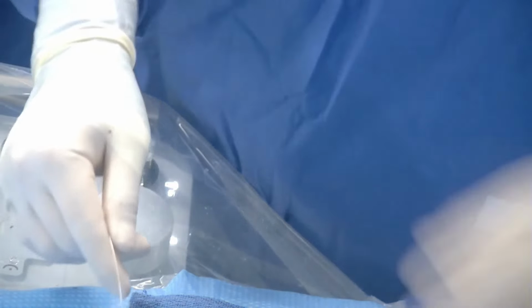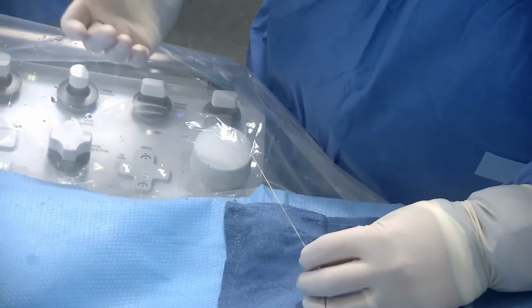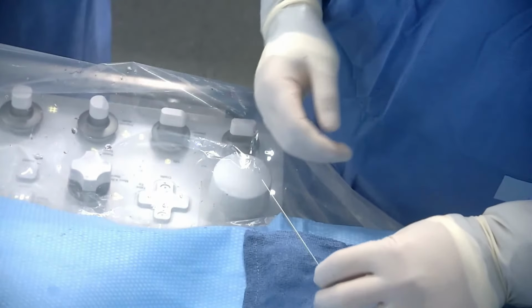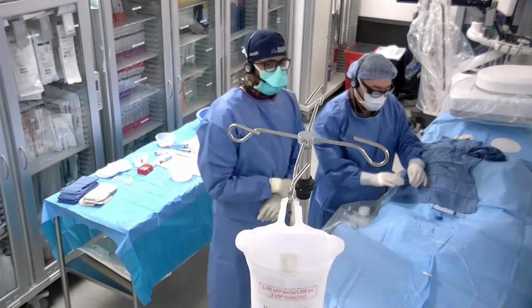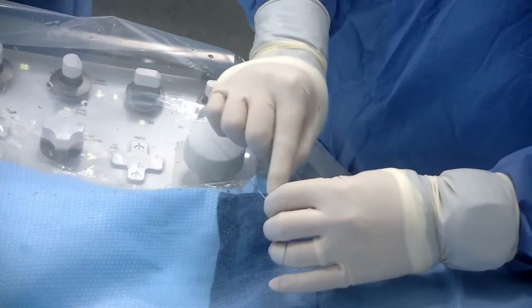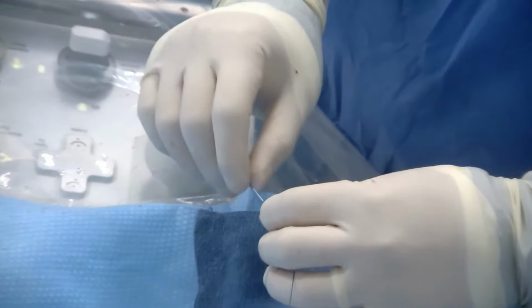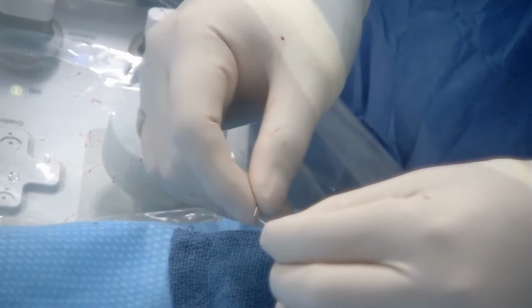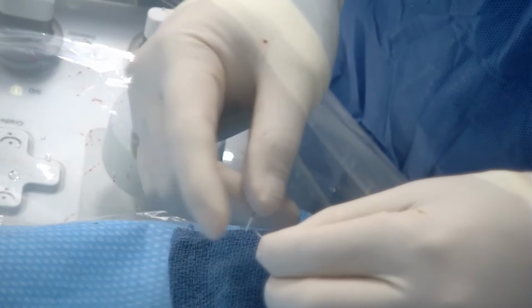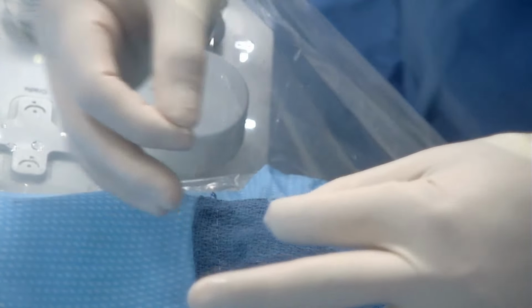As for the detachment mechanism, sometimes there's a separate handle or some other mechanism to deploy it. For this, there are two white strips, and in between there is no white. That's where you break it like this. You just snap it, and then there's an inner wire that will pull and detach.